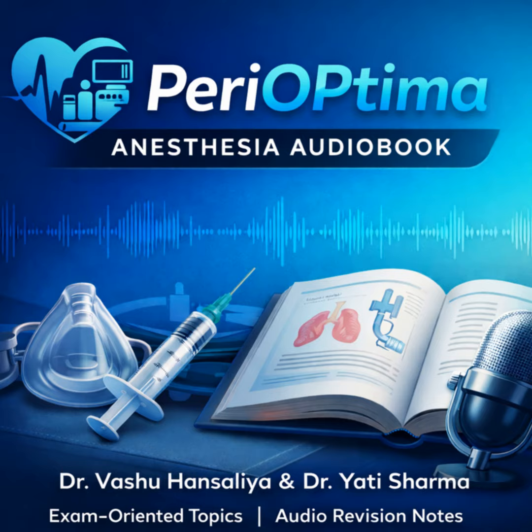So how do we tackle the upper airway? We start broadly. You can use 4% lidocaine via nebulization, or lidocaine gargles, to anesthetize the pharynx and epiglottis. What about for deeper, more localized anesthesia? For that, you can supplement with specific regional blocks. Bilateral superior laryngeal nerve blocks for the mucosa above the cords, and transtracheal blocks for the mucosa below the cords.